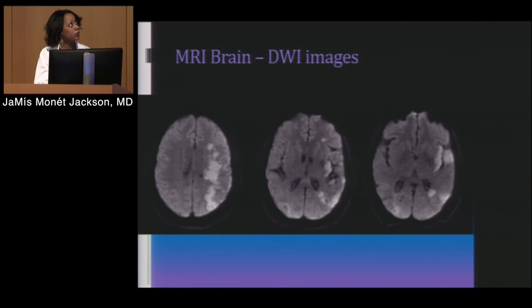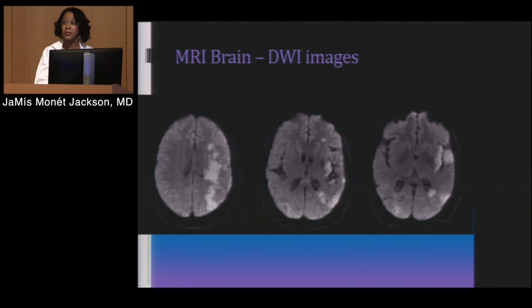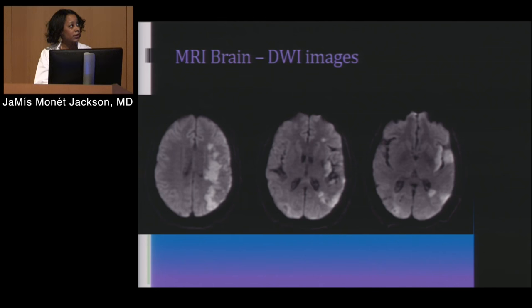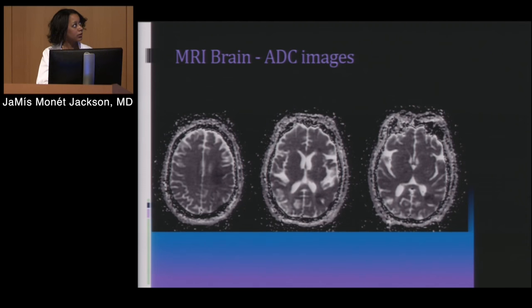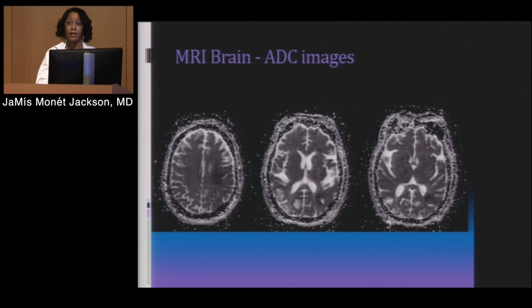This is her MRI. This is a DWI, and she has changes. Any time on DWI when you see bright — which we also have to correlate with ADC — that means there's diffusion restriction, which shows up as ischemia. The patient has had a stroke, and hers has affected multiple areas of her brain in the left MCA territory. It does correlate with ADC: on ADC you should see dark, and these two images have to be used together to truly diagnose ischemia or stroke.